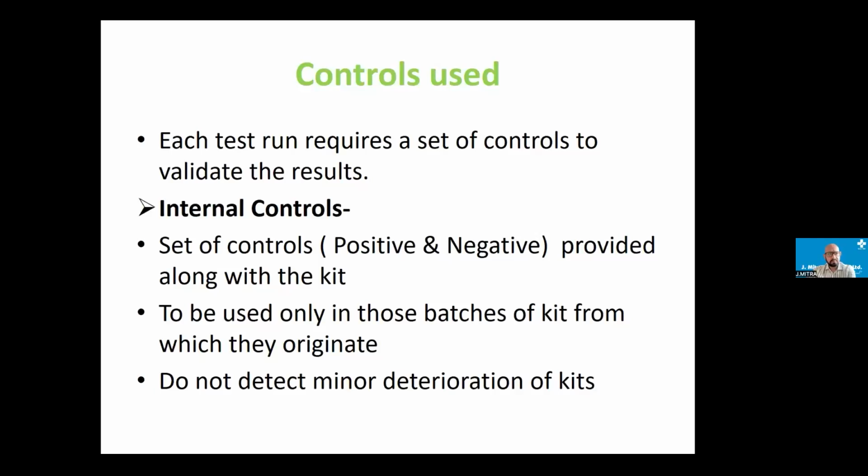I can't say it is viral load, as NAT detects the nucleic acid, DNA or RNA, whereas CLIA depends on antibody detection. They capture the antibody in the case of CLIA. So this false reactivity may be due to antibody production at a low level, or cross reactivity, maybe due to COVID infection or some respiratory or other viral infections that interfere with CLIA testing. That may give rise to these false positive results.